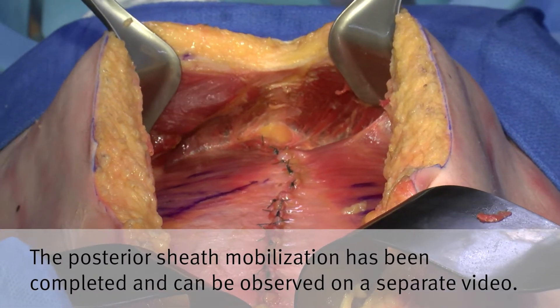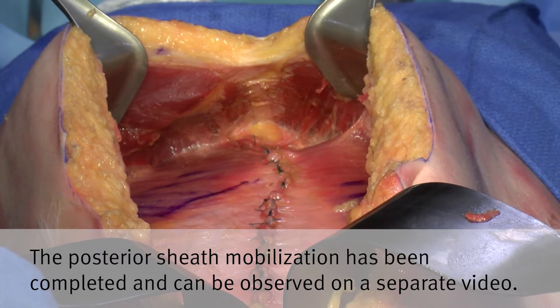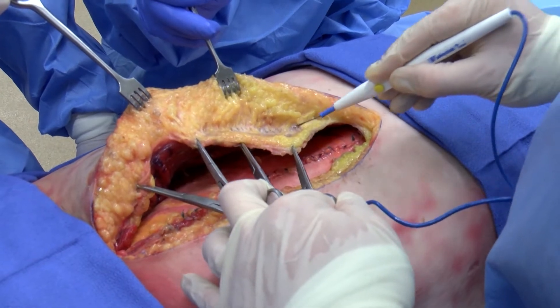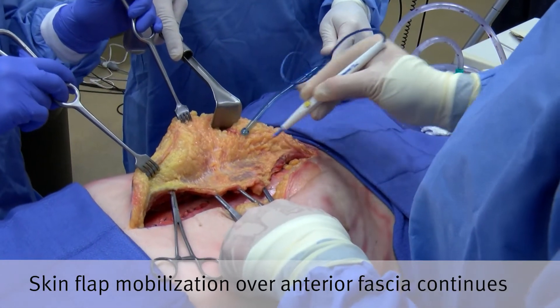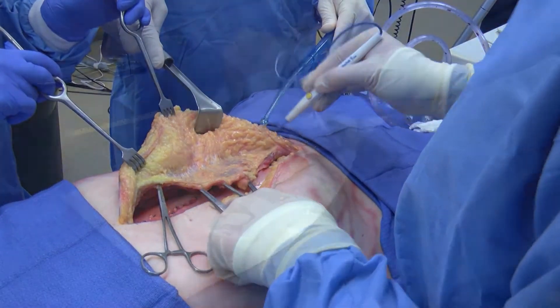In this example, the posterior sheath has been mobilized and completely closed. The retromuscular space is now ready for reinforcement. A skin flap is mobilized off of the anterior fascia to perform an open retromuscular repair, using electrocautery to the edge of the rectus complex or the linea semilunaris.